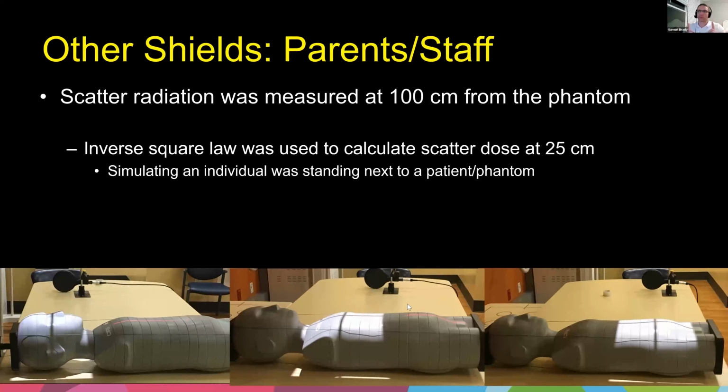But the collimator blades are very, very good, especially at high kV. At 125 kV, which you'll probably never go higher than, and down, it's stopping 99% of all the photons. Where there is no light, there are no X-rays. Now, there could be a little bit of scatter and a little bit of photons coming off, but that's happening all the way up here, high off the patient. Those photons almost always just scatter off into the room, and they're really, really small amounts.